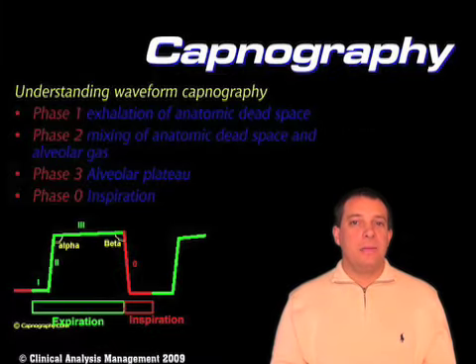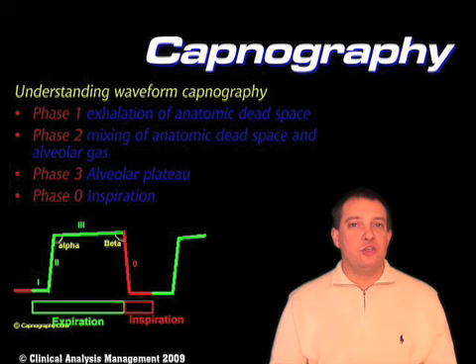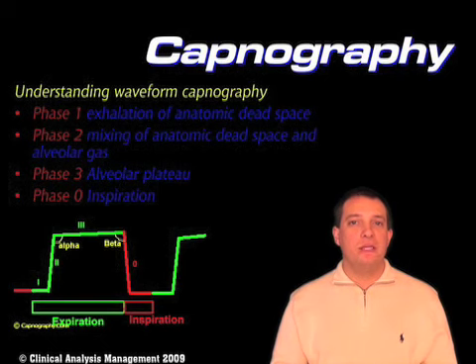Okay, now when we talk about capnography, based on what I just said, you may think that the views on capnography are negative, and that's not at all the case. Capnography is a tremendous tool. In fact, I would go as far as to say that it is one of the biggest things that we have done from a technology perspective in critical care and transport medicine in a long time. Capnography is a vital tool.